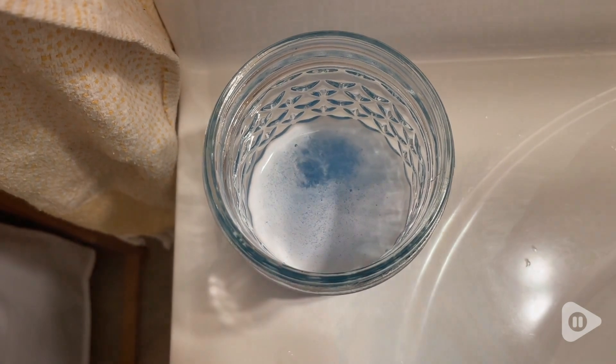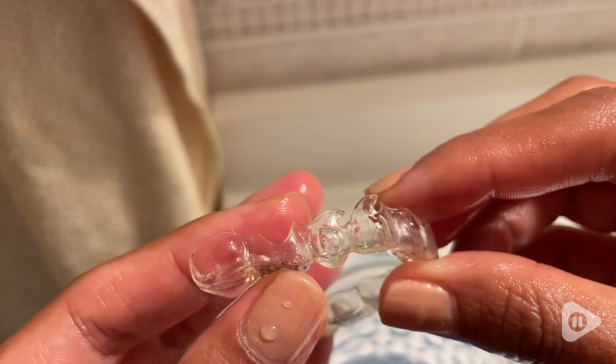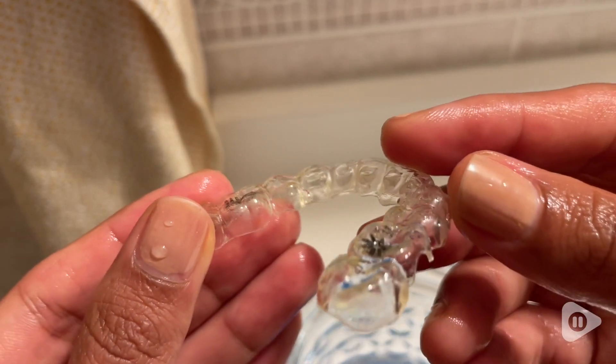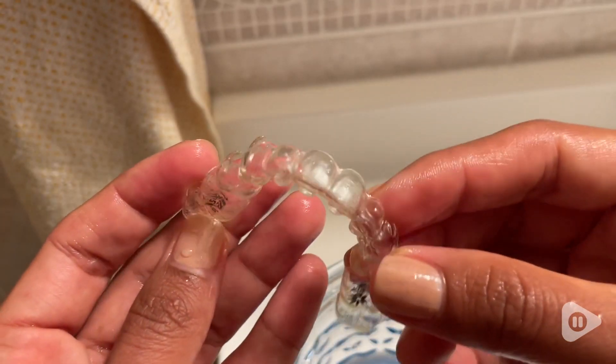They have a minty fresh smell that I've been loving. I also noticed that they look cleaner — this quickly removes stains and any buildup.